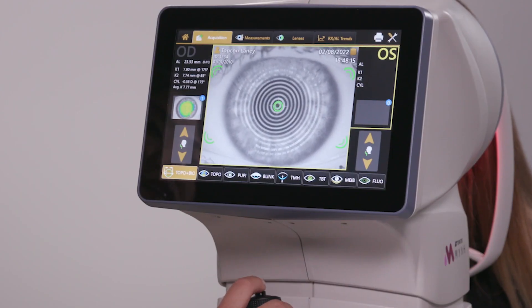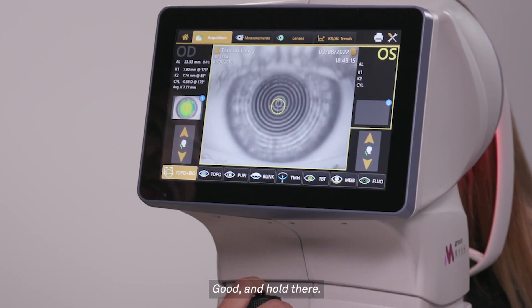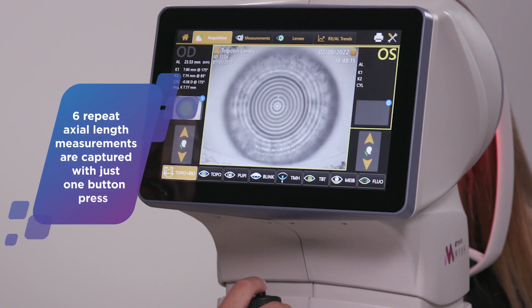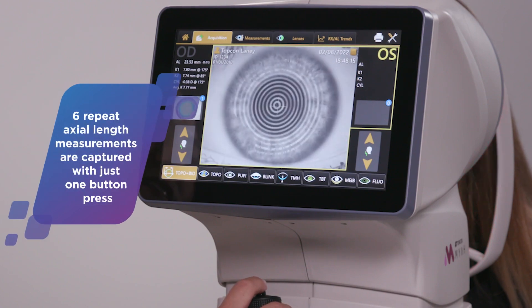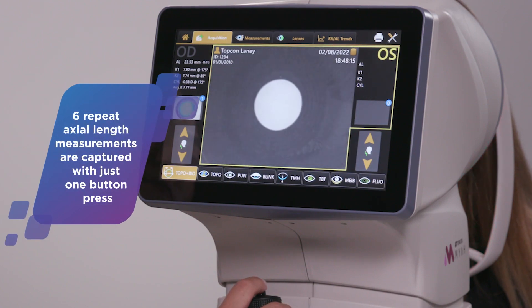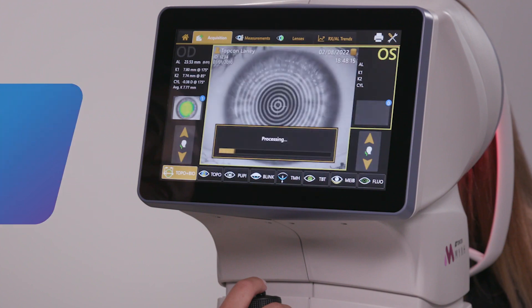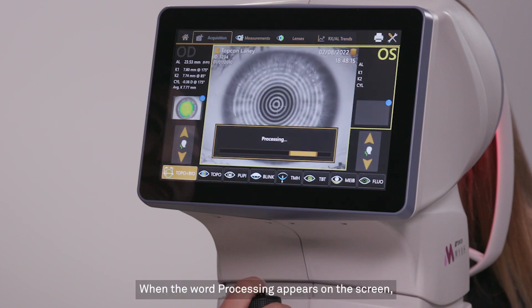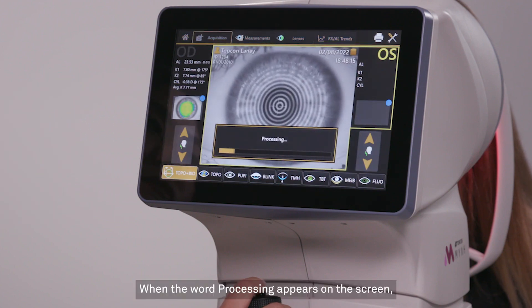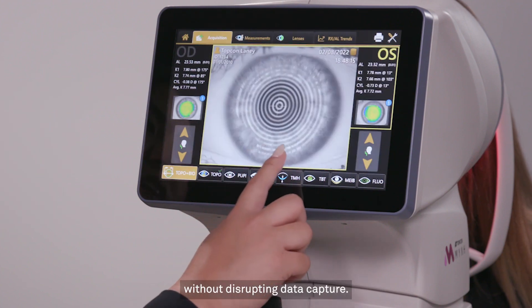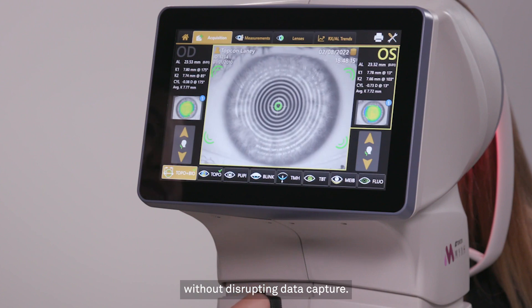Okay, blink. Good, and hold there. When the word processing appears on the screen, the patient can blink again without disrupting data capture.